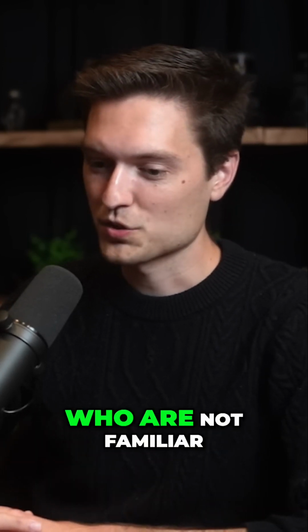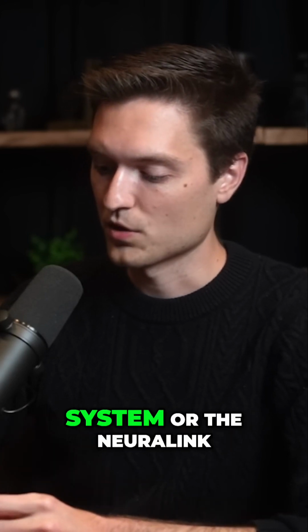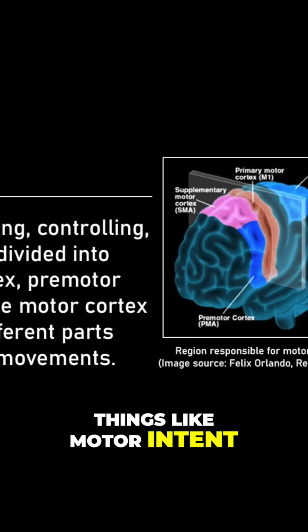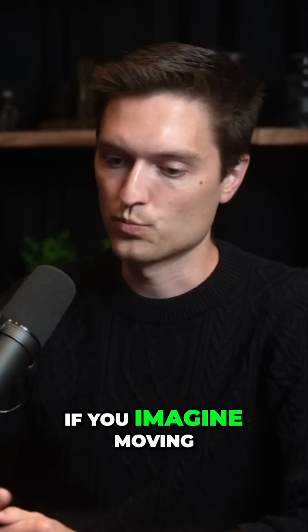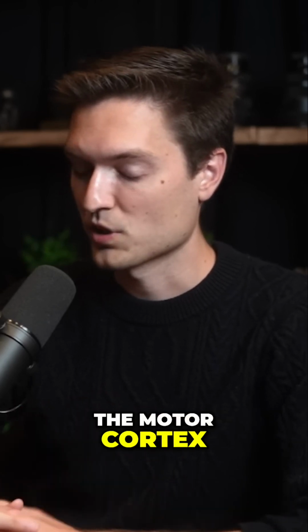And maybe for folks who are not familiar with the Neuralink system, we implant the Neuralink implant in the motor cortex. So the motor cortex is responsible for representing things like motor intent. So if you imagine closing and opening your hand, that kind of signal representation would be present in the motor cortex. If you imagine moving your arm back and forth or wiggling a pinky, this sort of signal can be present in the motor cortex.